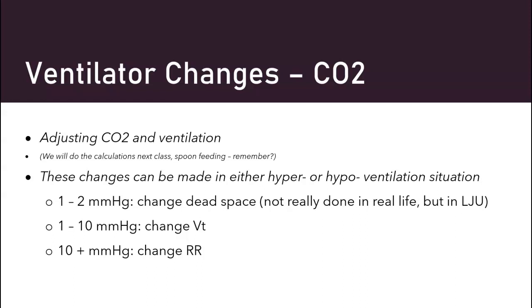If you are anywhere between 1 to 10 above or below on your CO2, increase or decrease your tidal volume. And again, we will do those calculations. You can start looking at those calculations if you want and start kind of playing with them. That's totally appropriate. But you will increase or decrease your tidal volume.